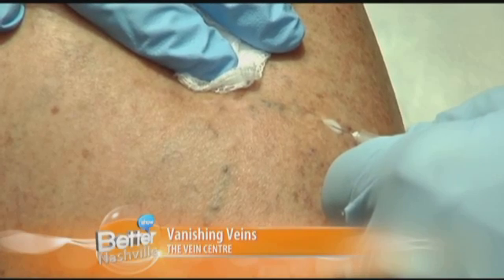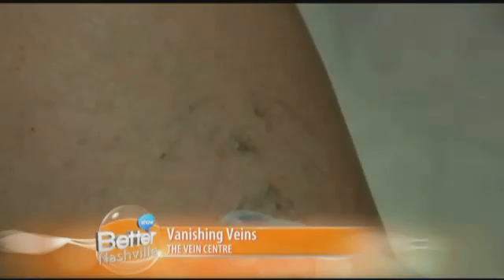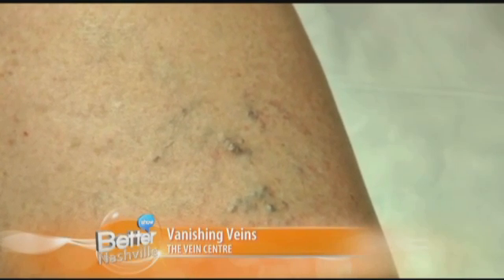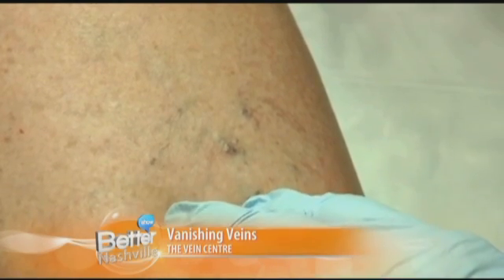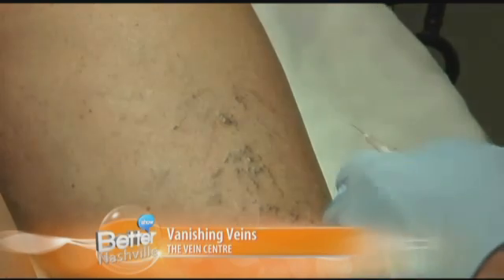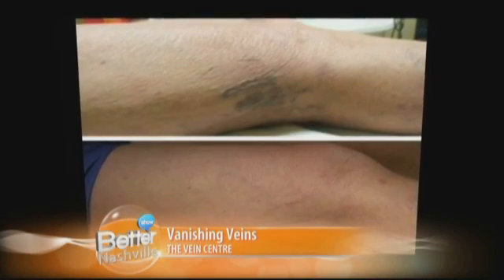But that's temporary. You'll see when we inject it, it's fairly dramatic in that the vein tends to go away immediately. It then comes back kind of with a vengeance, as I tell people, because what we're doing is causing an inflammatory response, and so your body then tries to clot this off and absorb it. The treatment is done in a matter of minutes, and it's practically pain-free.